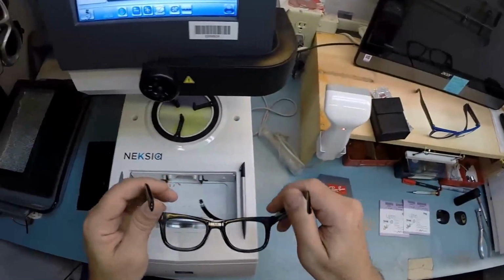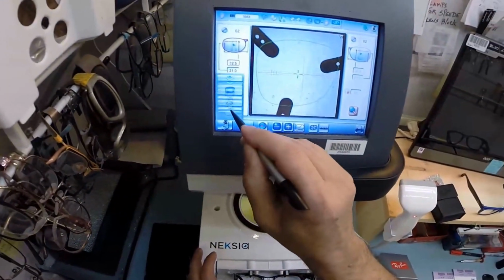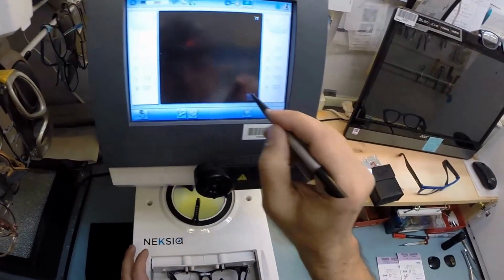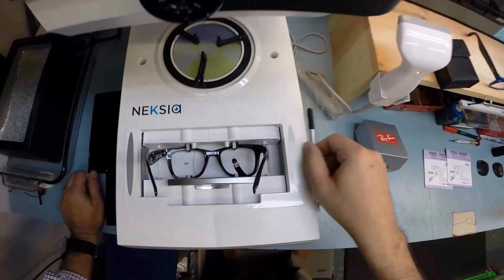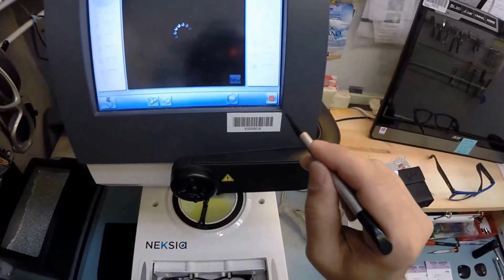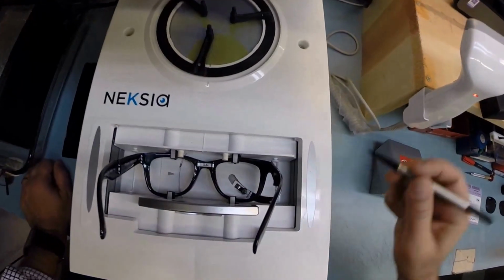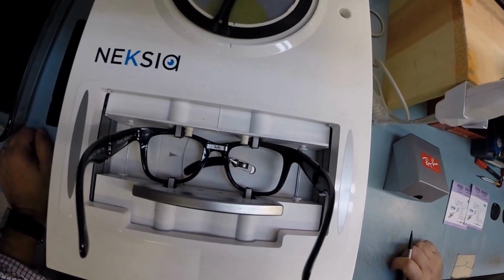So I'm going to take the frame, put it into the tracing element of my edger, and we're going to trace what we have got here. Just programming the computer. Now everybody wants to know what shape lens to cut. Hang on, I hit the wrong button. There we go. This little stylus is going to pop up and it's going to go around and trace the shape of the right lens before doing the same thing on the left.